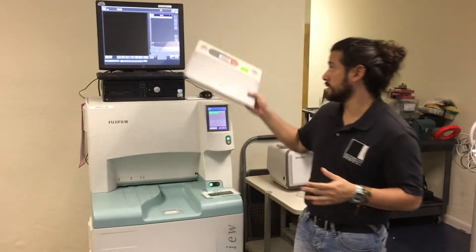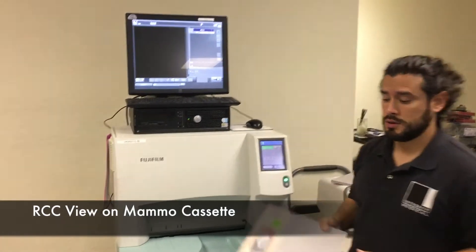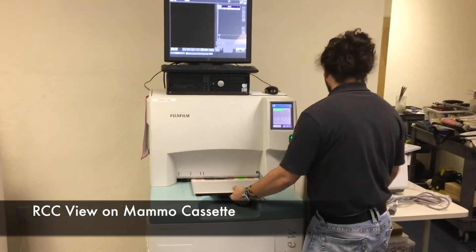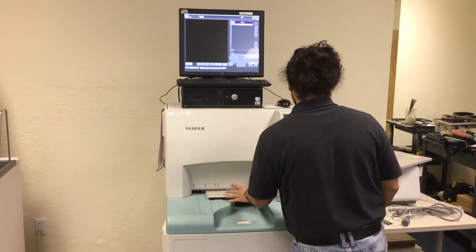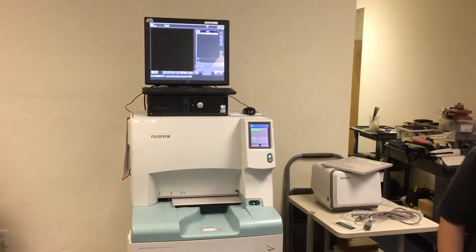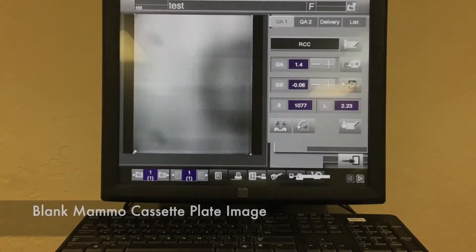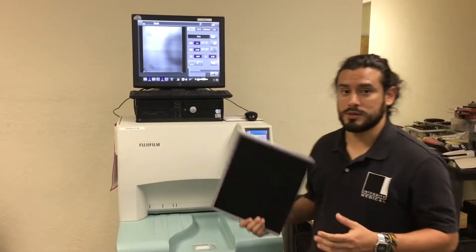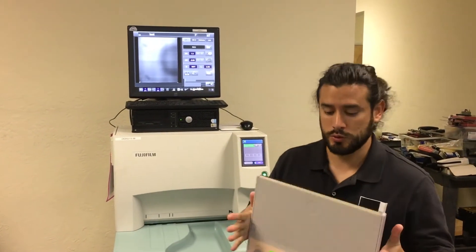We have selected the RCC view. We're going to use the regular mammo cassette. That was a mammo cassette — it was a blank cassette, not exposed.